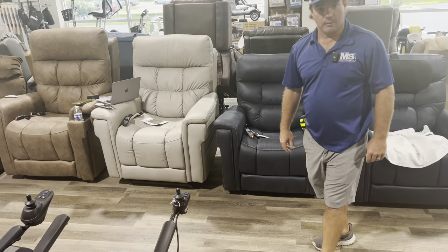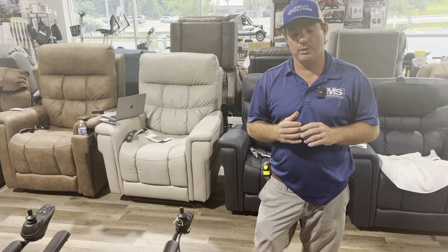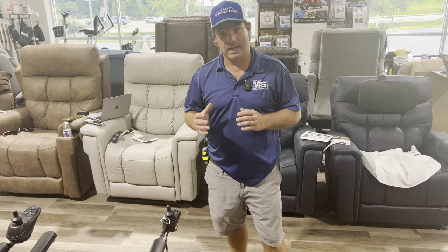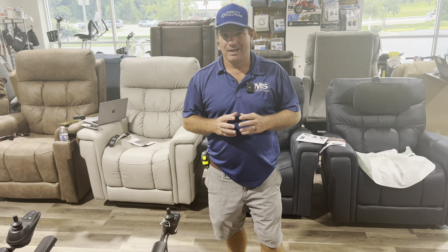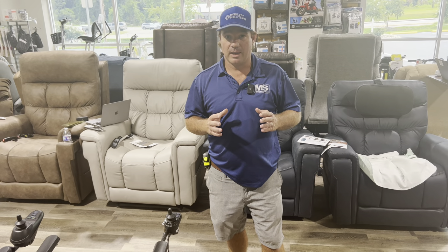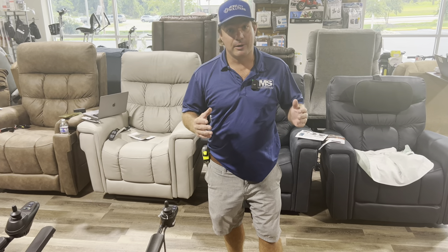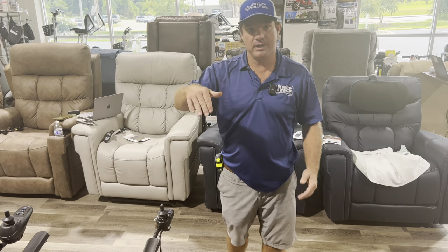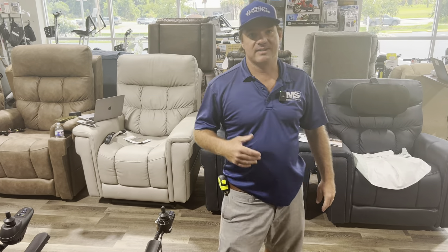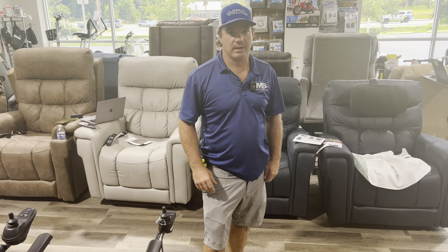Andre actually works in a recliner all the time but we sell it as a recliner. If you're looking for a lift recliner and you're talking to your mom or your dad and you say 'hey let's go get you a lift chair,' there's a good chance they're not going to want to do that. But if you say 'hey let's go get a recliner' and then show them the recliners, then show them 'oh cool, this also can help you get up' — they tend to want to sit in it and try it out. So just remember that: lift recliners.